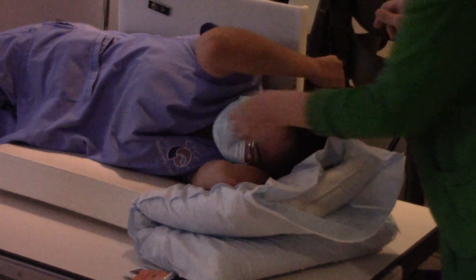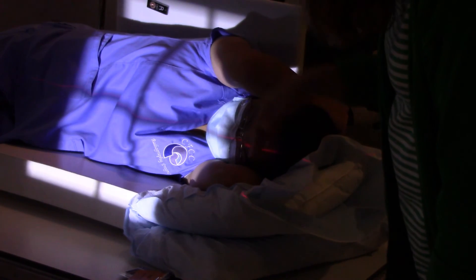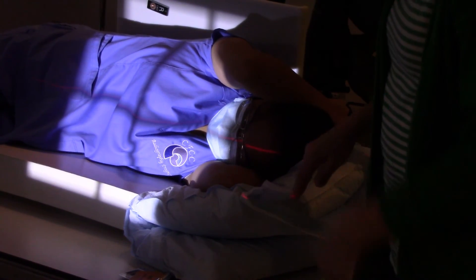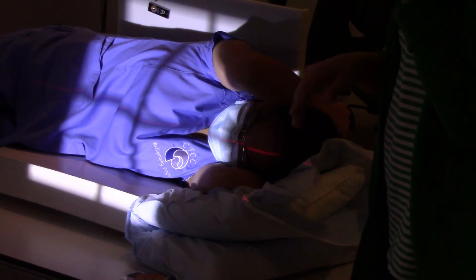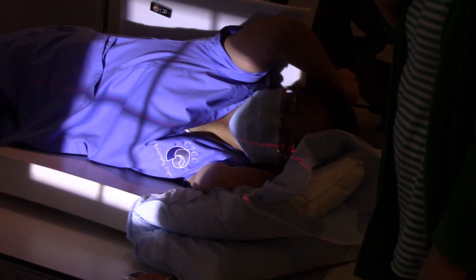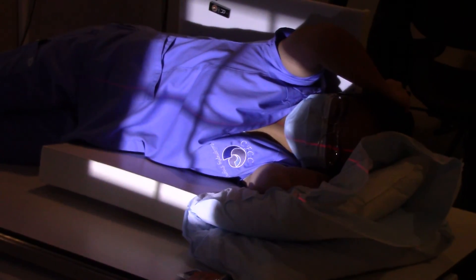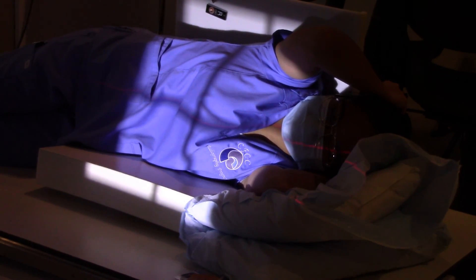Look at her chin — is her chin in the image? No. But if you were concerned about that, because sometimes with short necks it could be, you can just get her to raise her chin up. Do you see how that gets the chin out of the image? Short necks. She's out of it — good job.